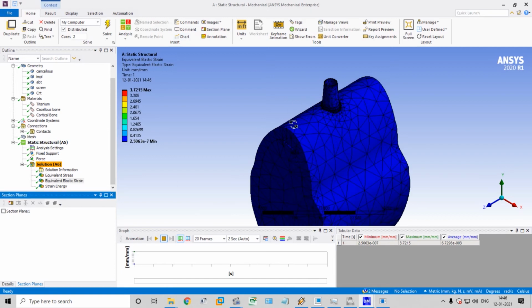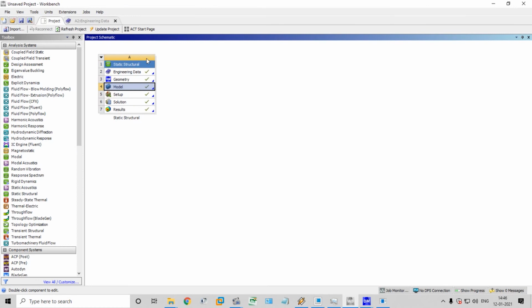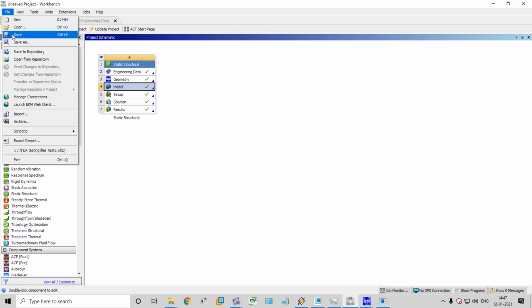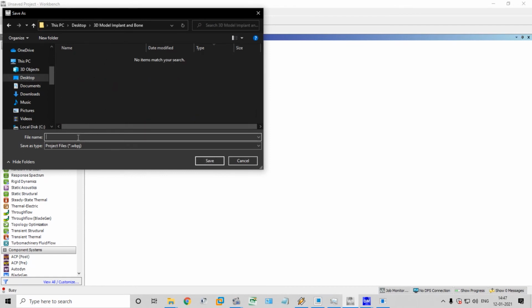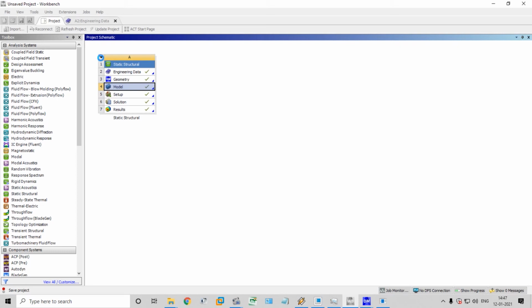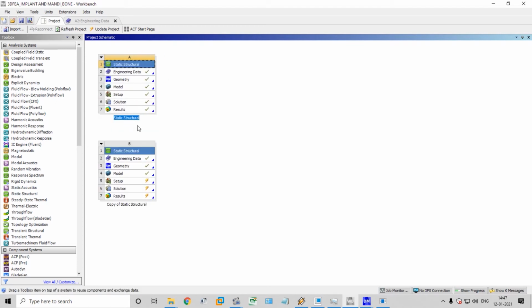Just unmark the section plane, it will completely show. Okay, we can duplicate this result also. Before that we should save the project where it is. 3D FEA implant and mandibular bone. Okay, saved. Saving completely. Okay, now we can duplicate this result, static structural. This is the axial load.